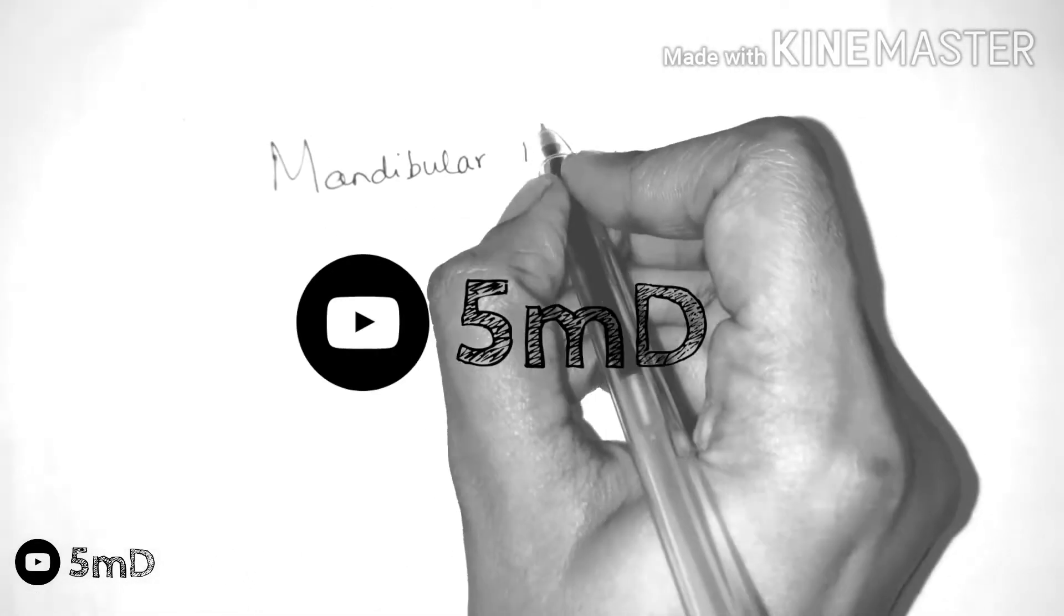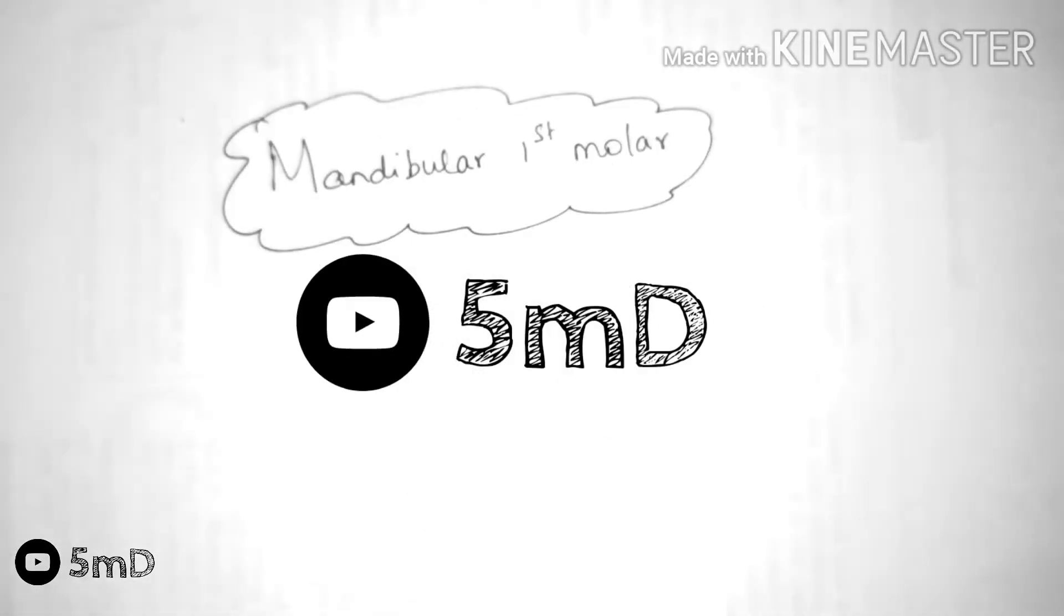Today let us see about locating canal orifices in the mandibular first molar.